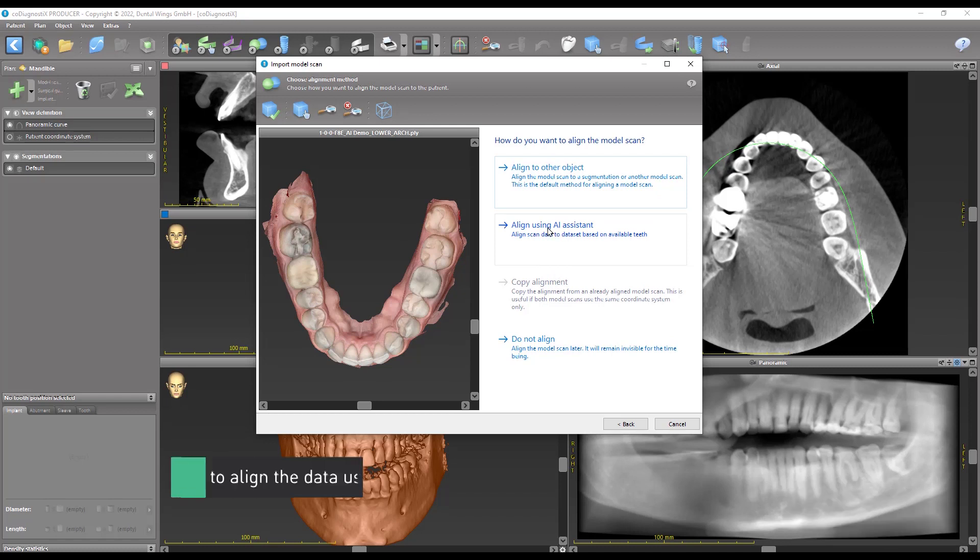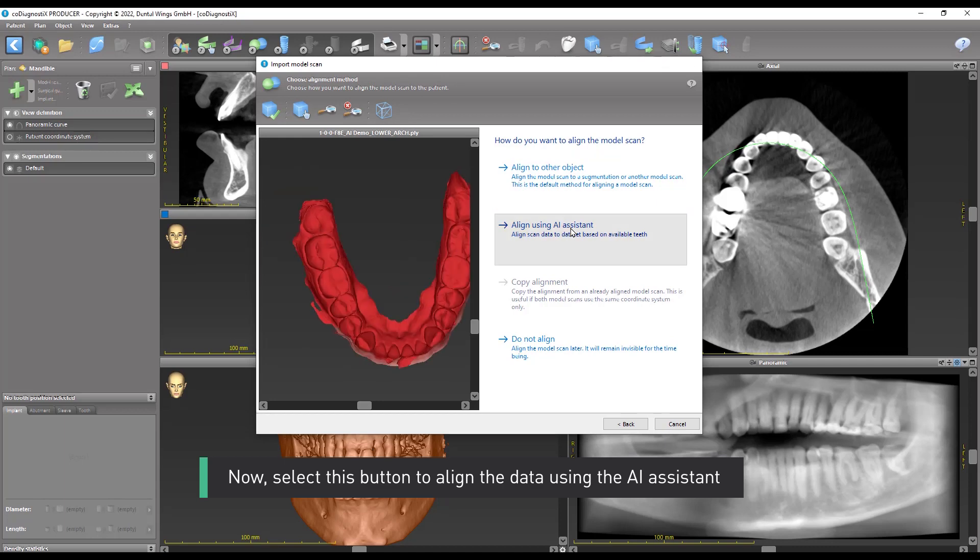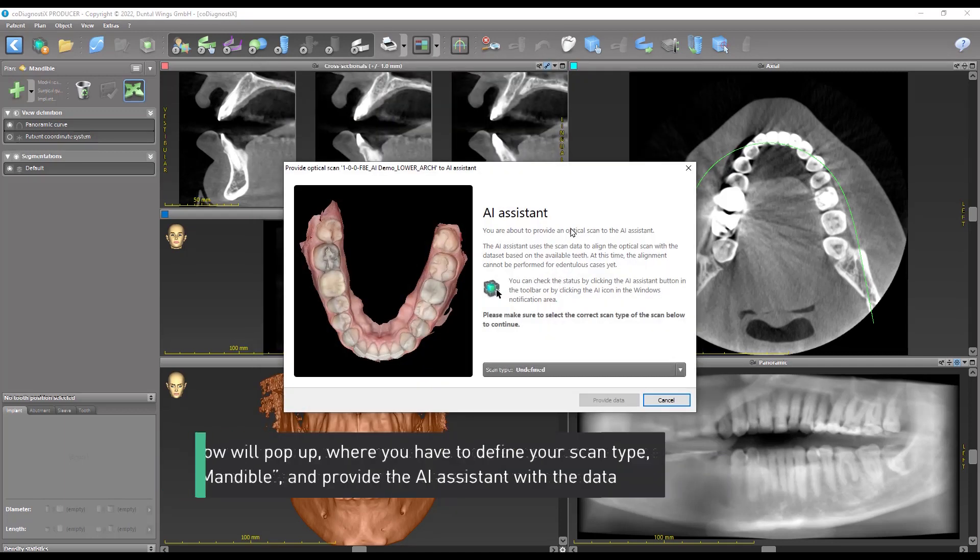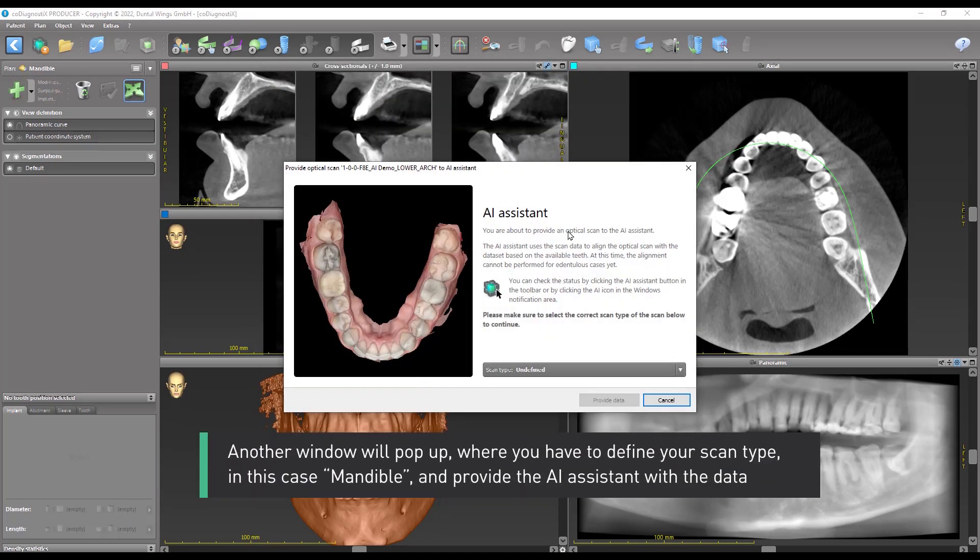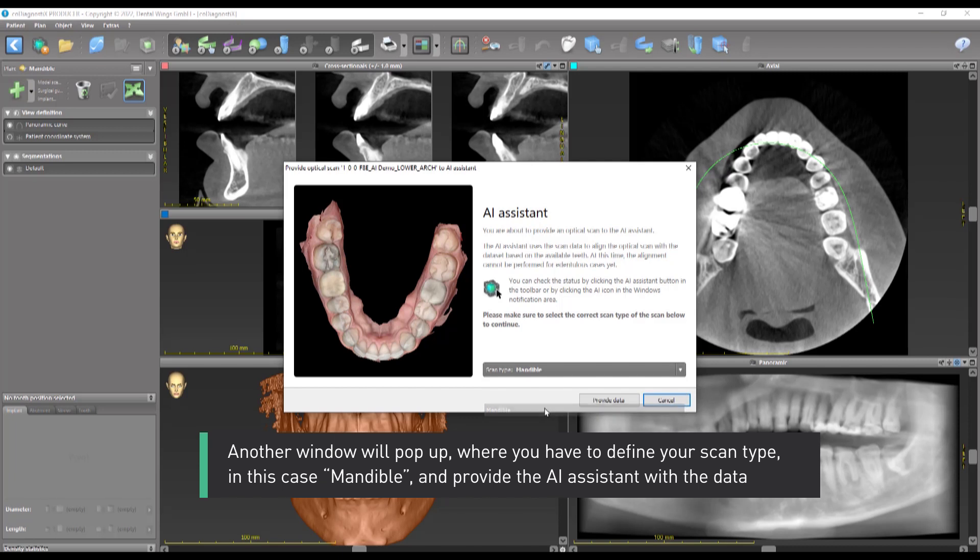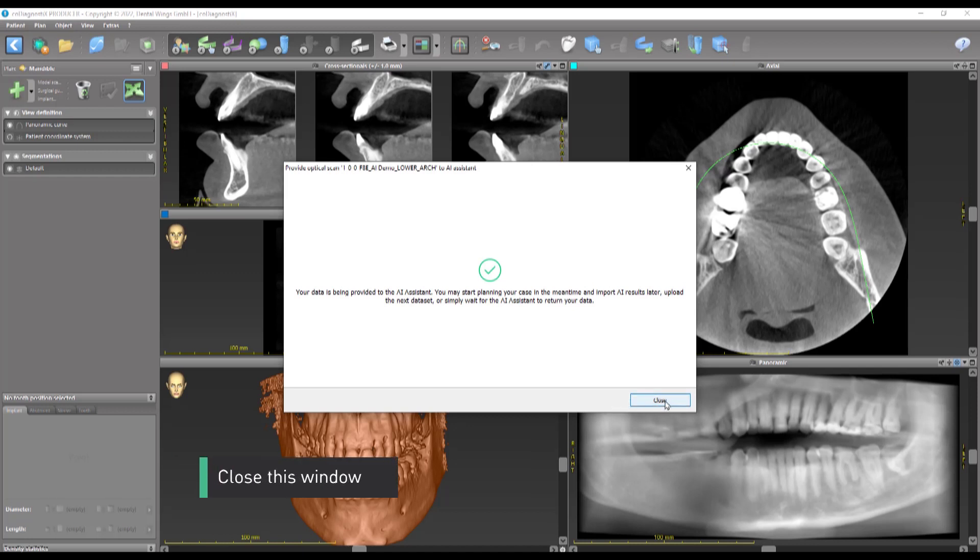Now select this button to align the data using the AI assistant. Another window will pop up where you have to define your scan type. In this case, Mandible, and provide the AI assistant with the data. Close this window.